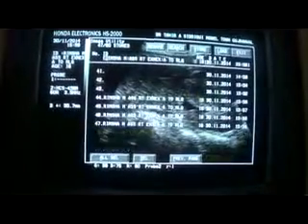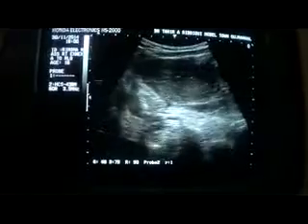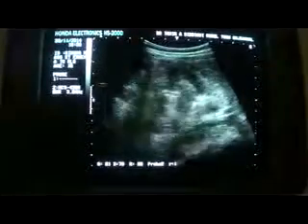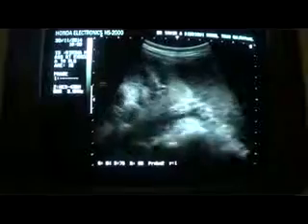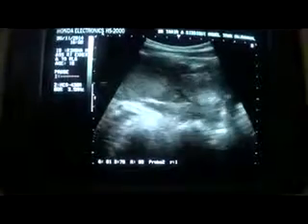With no history of any surgical intervention before, now here what we see is that the mass extends up to the right lower abdominal quadrant. Now the mass moves laterally.